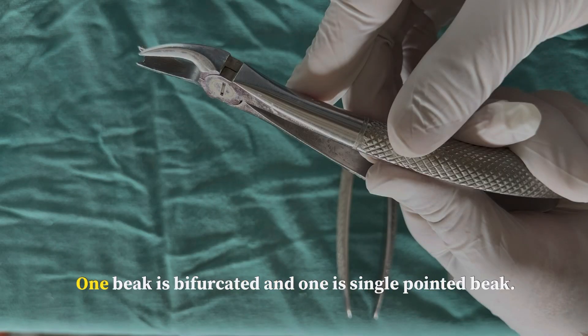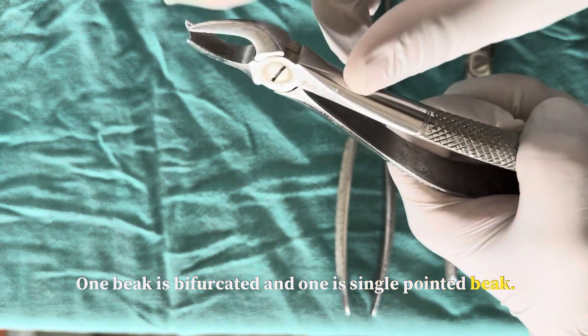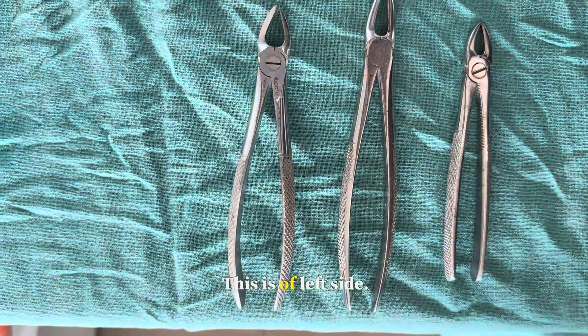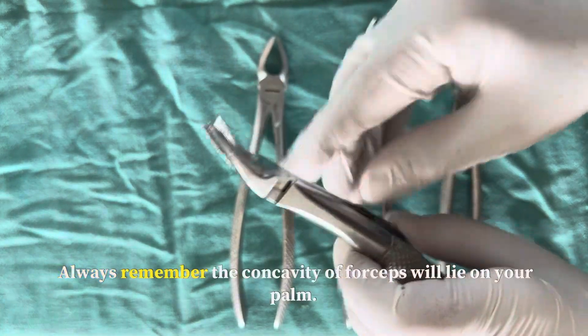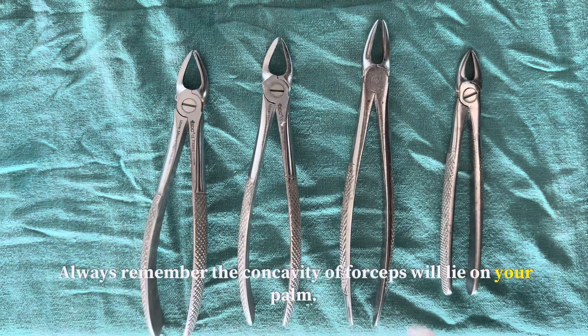Now this is the maxillary cowhorn forcep. One beak is bifurcated and one is a single pointed beak. The single pointed beak will engage the furcation on the buccal side. This is the left side cowhorn forcep. For the right side cowhorn forcep, always remember the concavity of the forcep will lie on your palm.